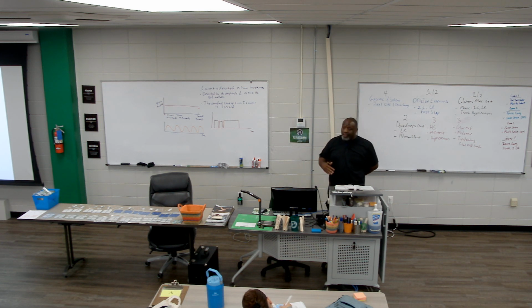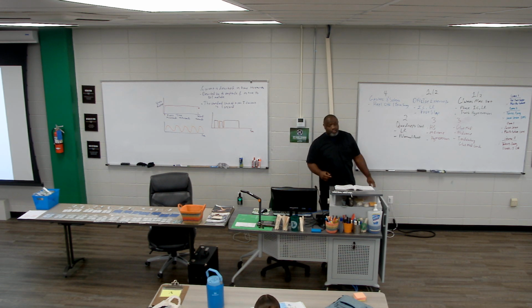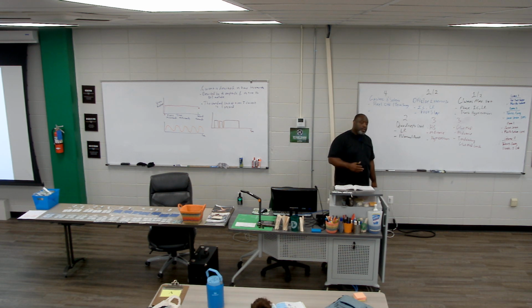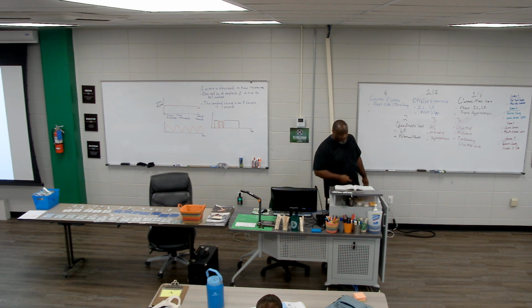The manufacturer will determine if their device is an AC-based unit, a DC-based unit, or a pulsatile current unit, and if the pulse currents they offer are monophasic, biphasic, or polyphasic. So the manufacturer determines all of this. We don't get to choose this. We get to choose the different types of waveforms, and we'll talk about why we would choose one over the other, but we don't get to set these. This is preset by the manufacturer.